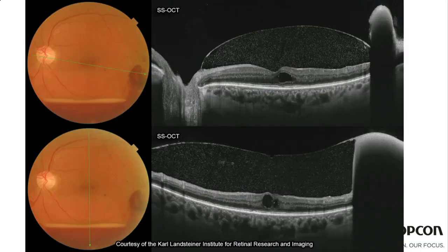But here's another example of how well it actually penetrates through opaque media. Here you've got the subhyaloid hemorrhaging, and you can penetrate right through it. You can see the thickening of the retina, but you see also that the choroid has thickened. Obviously, there's a limit to how much blood we can go through. If you have this much blood, which is like here, or this much blood, which is a pool of blood, we're not going to be able to penetrate through that. But if you have this type of blood, which you have in a lot of diabetic retinopathy patients, we need to be able to see through that.